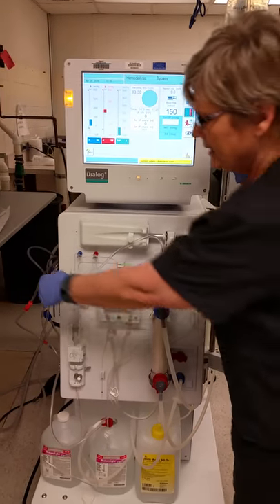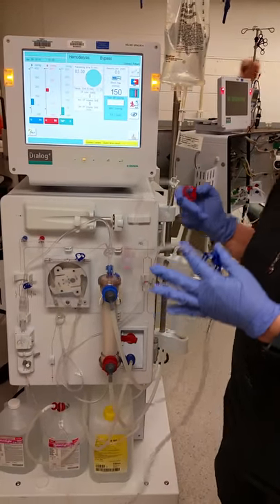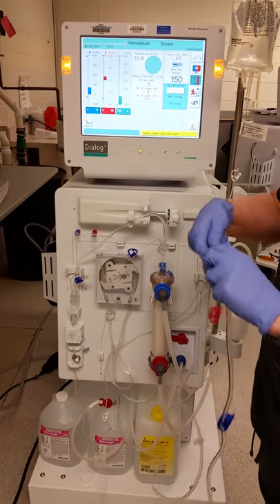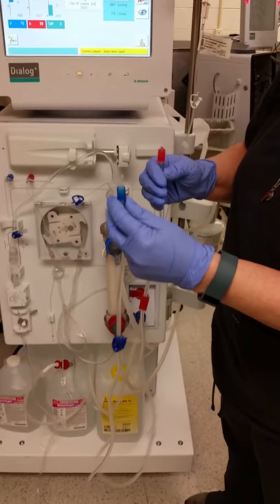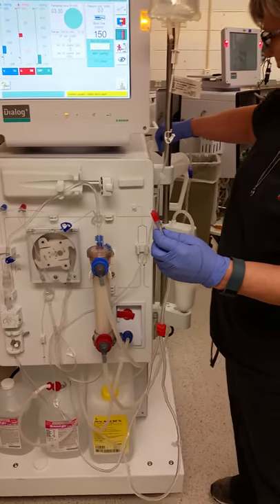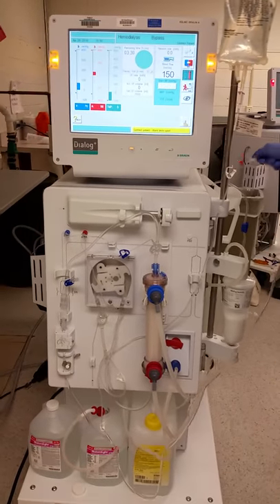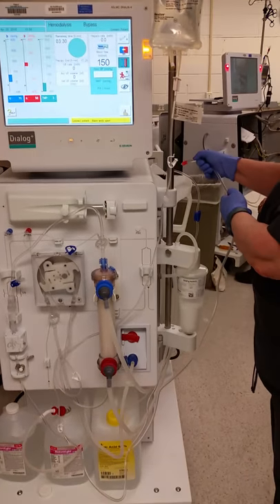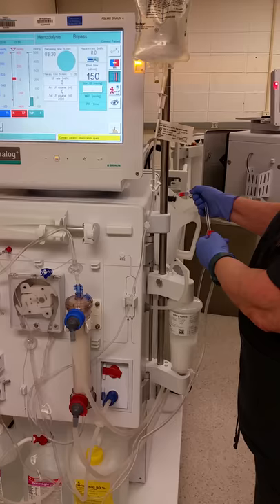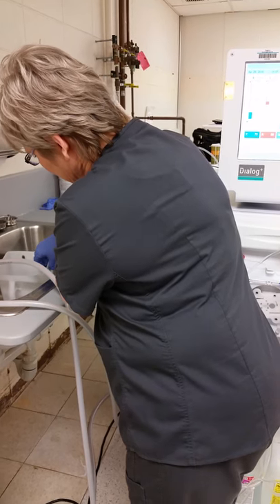The machine will automatically stop your pump. Now we need to take our lines and remove the saline within the system. We're going to clamp both lines, undo the tube, and keep the recirculator on the venous side for now — keep it sterile and clean. Put the arterial line back in the bucket, then open up the arterial line over the bucket and let it go for three seconds: one one-thousand, two one-thousand, three one-thousand — then clamp. At this point, connect it to the access of your patient, leaving it clamped.